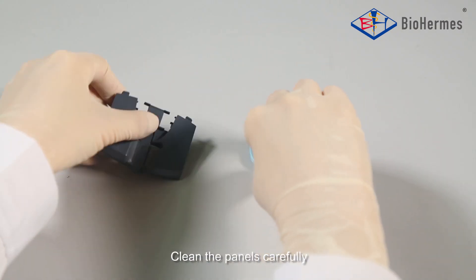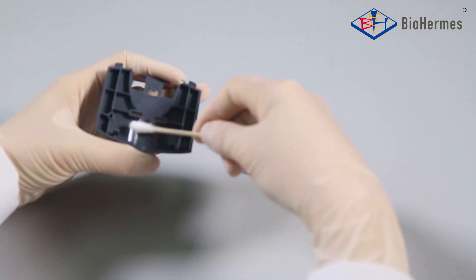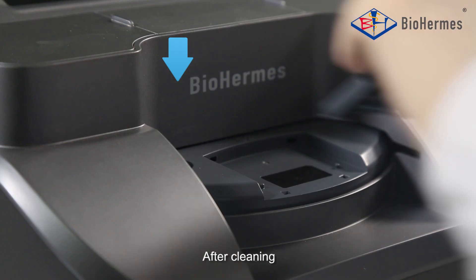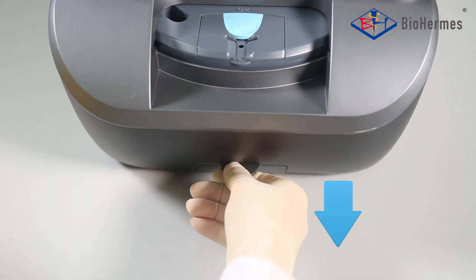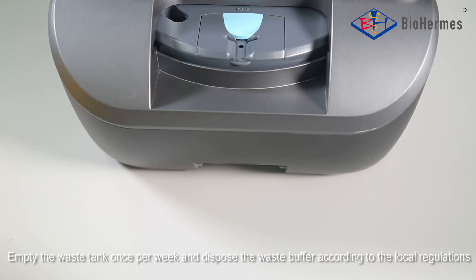Clean the panels carefully. After cleaning, reinstall the large and small panels back to the analyzer. Empty the waste tank once per week and dispose of the waste buffer according to local regulations.